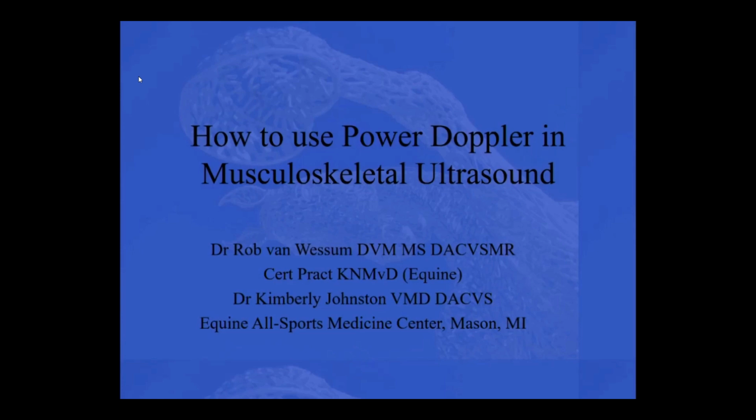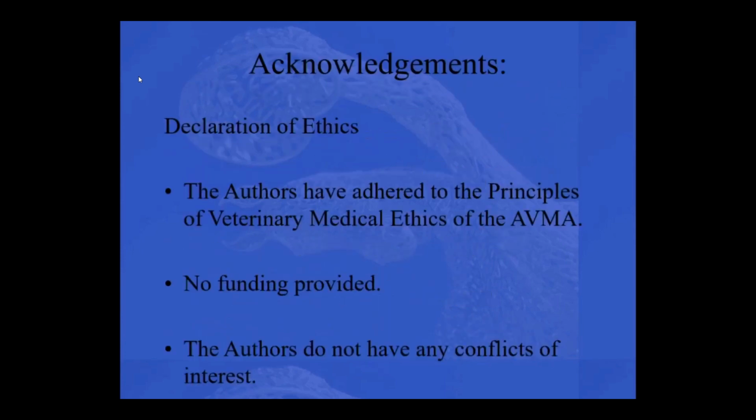Thanks for the introduction. I'm very happy that I can show you some newer techniques that are not very common yet in equine medicine or ultrasonography, and it's the use of power Doppler. I'll go a little bit more into detail what it is, how you use it, and then show you some fun pictures of what you can do with it.